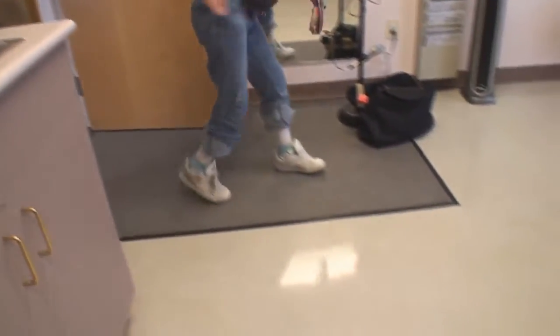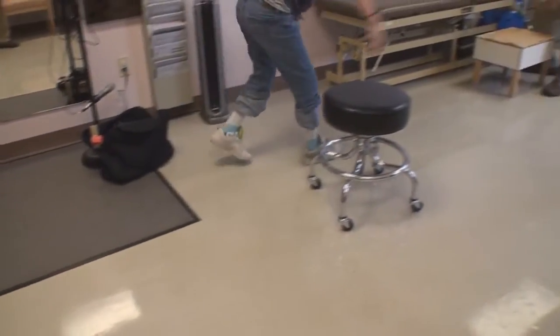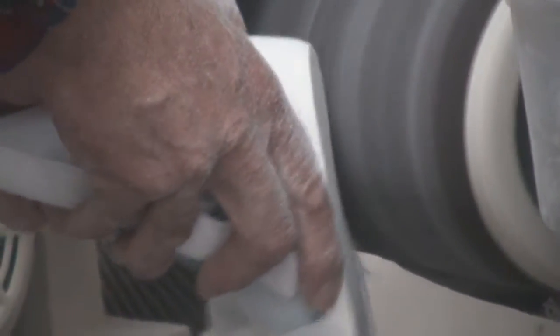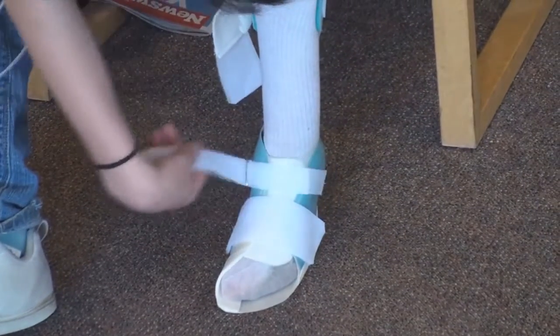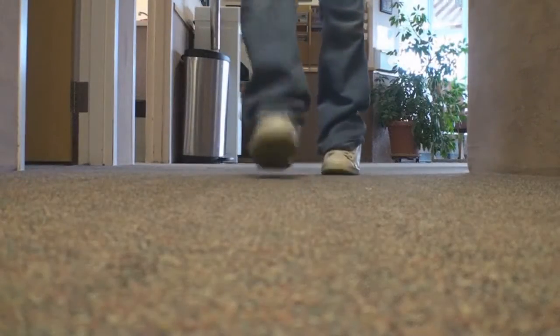Still too high in the back? The heel lifts too high. Usually it takes a family at least two weeks to build up full wearing time if they're fairly new to braces, and to confirm that everything's working.